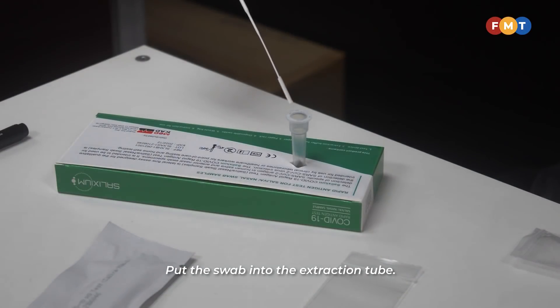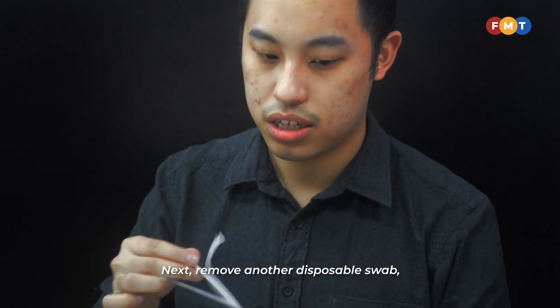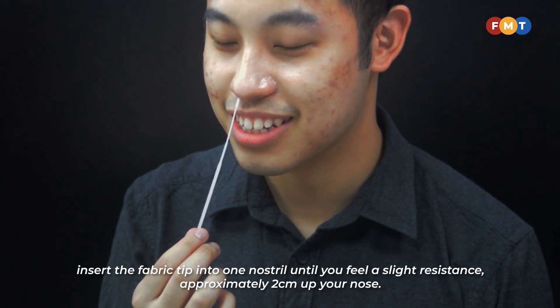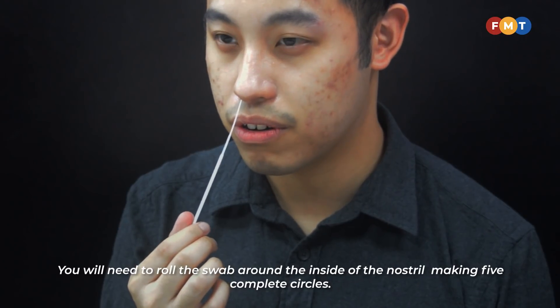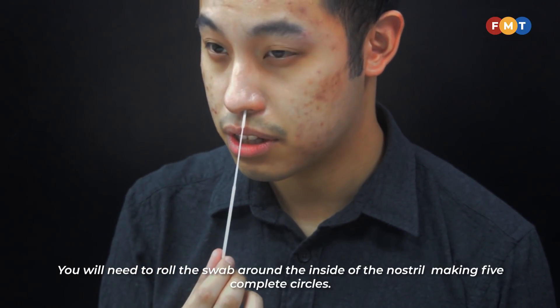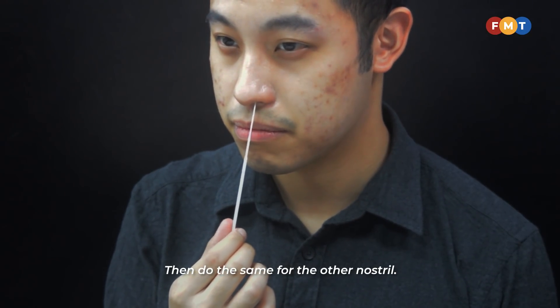Put the first swab into the extraction tube. Then remove another disposable swab. Insert the fabric tip into one nostril until you feel a slight resistance, approximately two centimeters up your nose. Roll the swab around the inside of the nostril making five complete circles, then do the same for the other nostril.